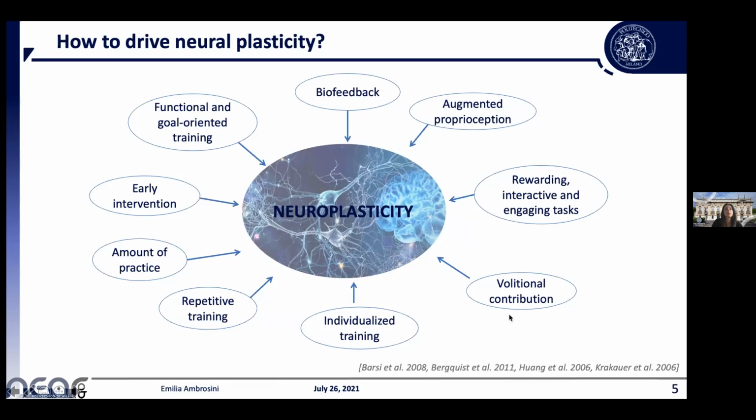It is very important that the subject himself contributes voluntarily during training. It is important to engage the subject, and then rewards, interactive and engaging tasks are very important. It is also important to augment proprioception and to provide biofeedback that could be acoustic, visual, different types of biofeedback.